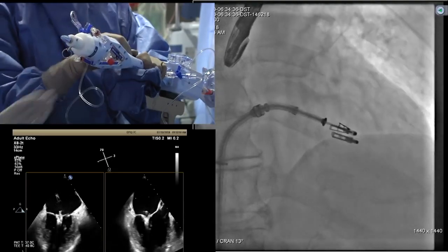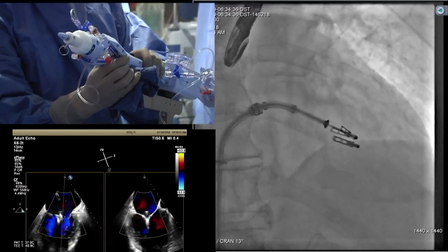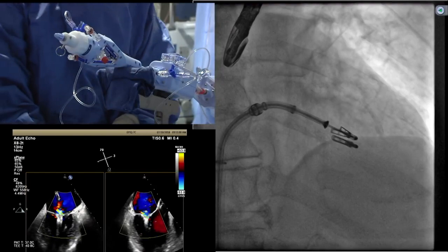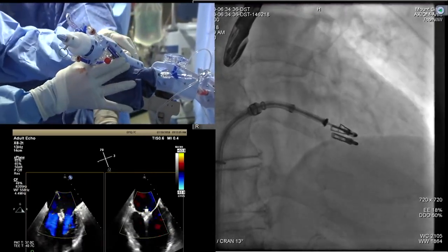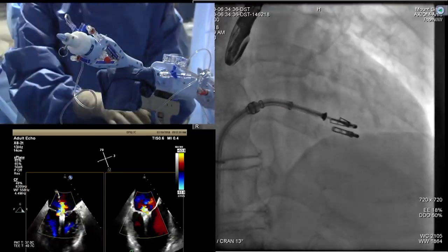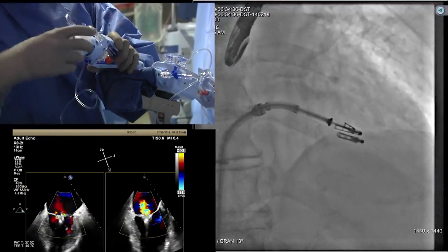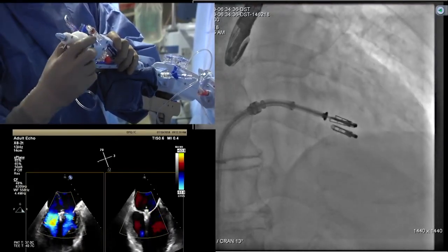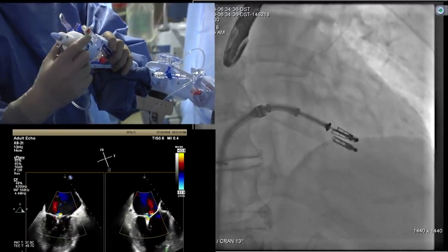And undo the tension, release tension. Color? Yeah, put the color. I release the tension a little bit. You can close. It is badly shown from the side. Okay. I think we're ready to close. I think the position of the second clip is beautiful on the angiogram. On the fluoro it is very close. It's perfect. It's not in contact. It's very good positioning. Nice.